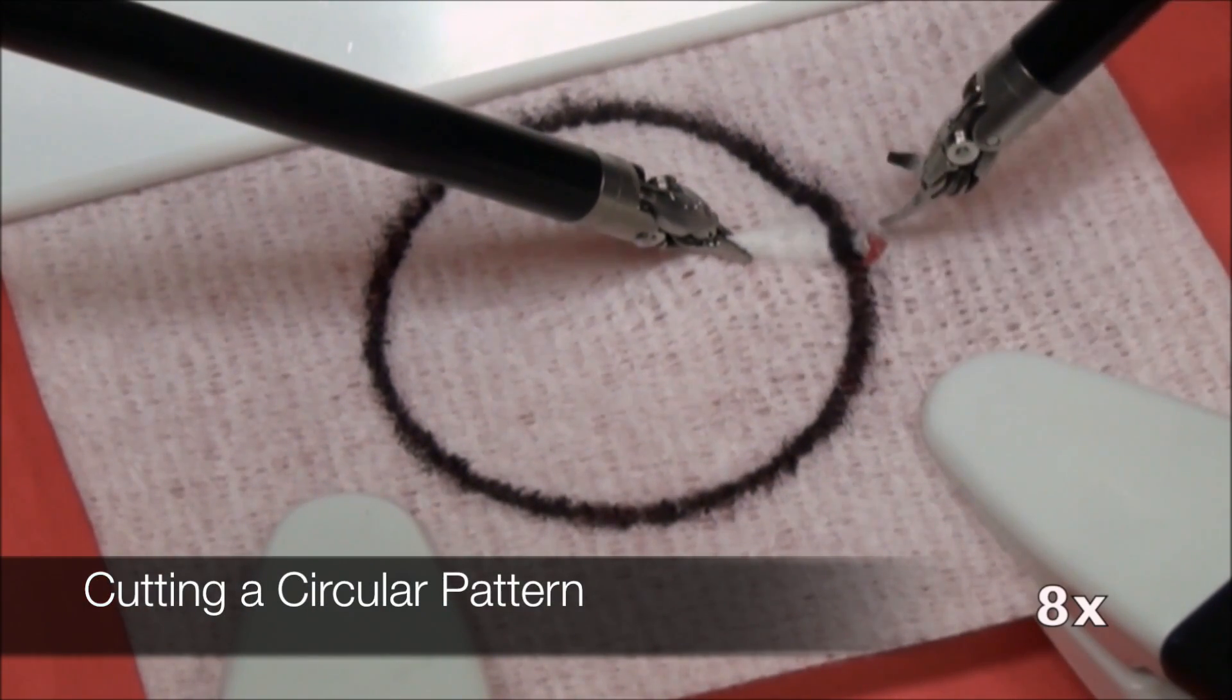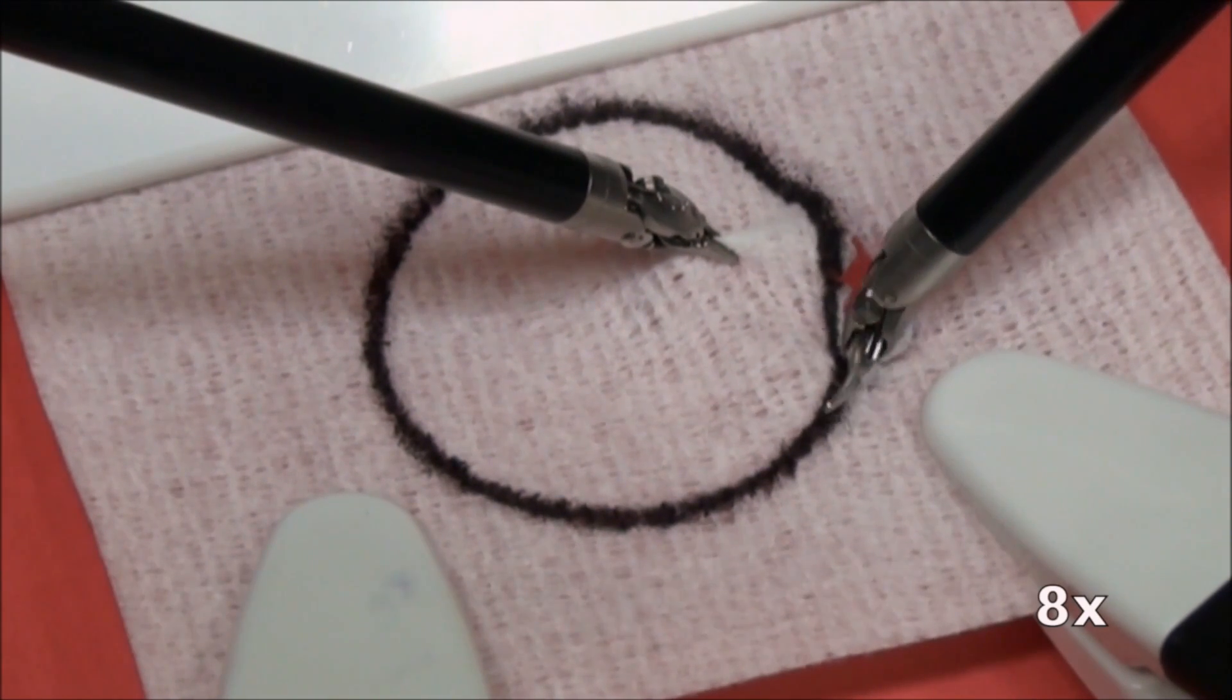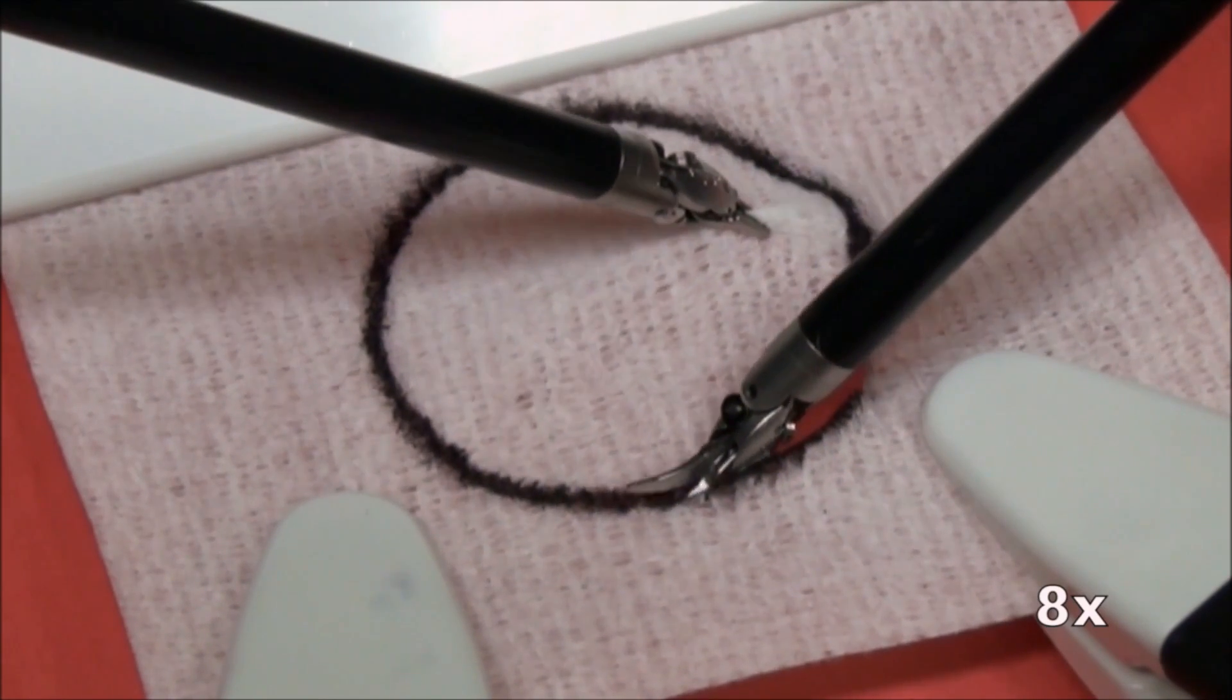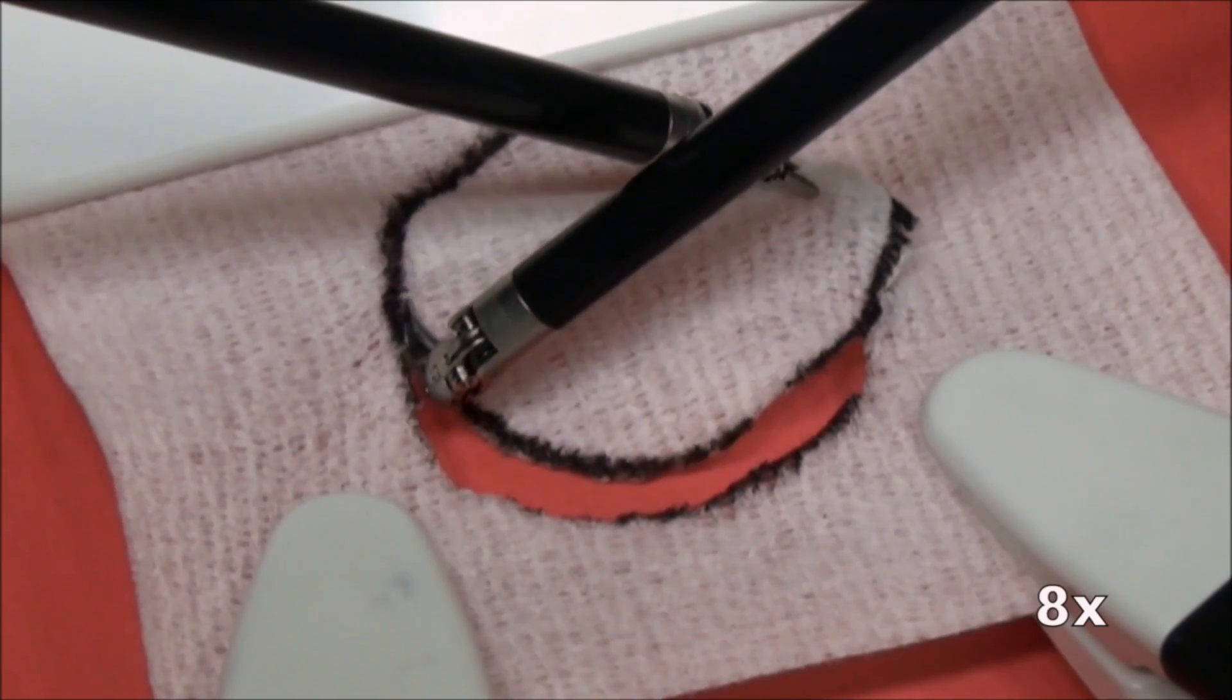This subtask is from a laparoscopic surgeon's training kit, cutting a circular pattern from a sheet of gauze. A computer vision system identifies the circle and guides the robot to cut along the lower and upper halves. The second gripper stretches the gauze, while the first gripper cuts the pattern.